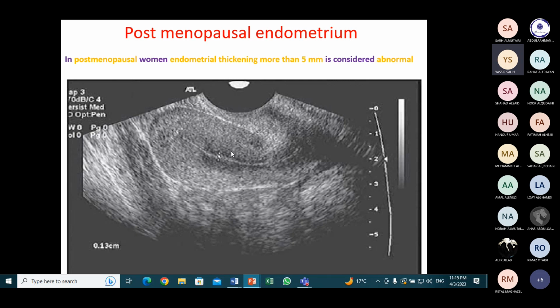In transvaginal ultrasound, the bladder is empty, so you are not able to see the urinary bladder, because there is no urine to do this transvaginal ultrasound. So this is transvaginal ultrasound. Also, you can see the uterus.